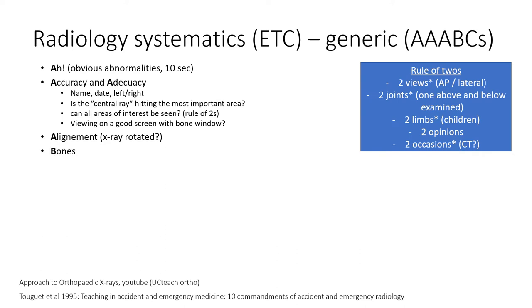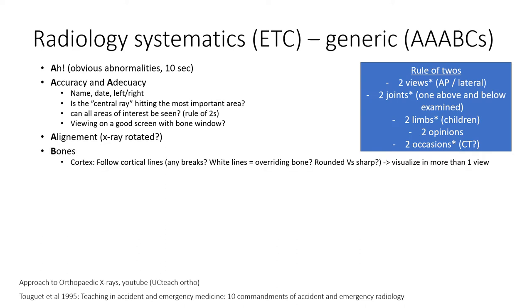Then you check the bones, you check the cortex, follow the cortical line. Are there any breaks? A break is by definition a fracture, if you can verify that it's on two views.